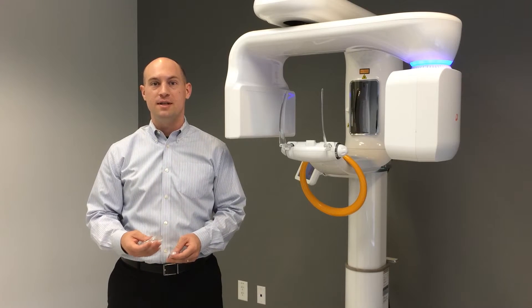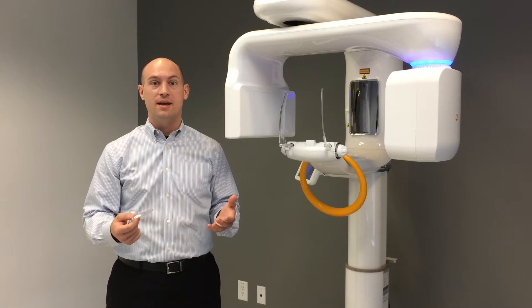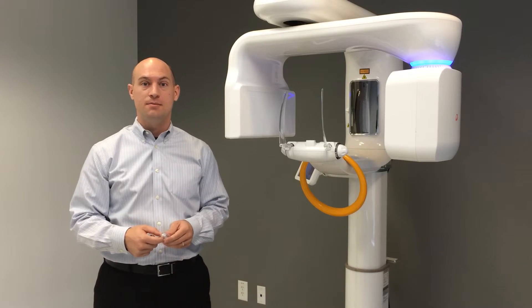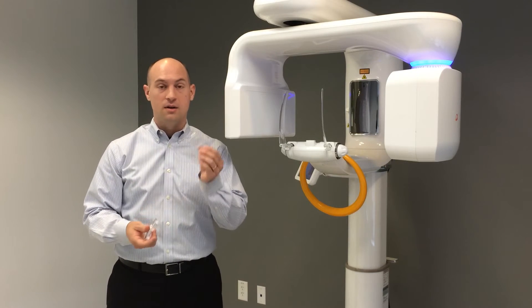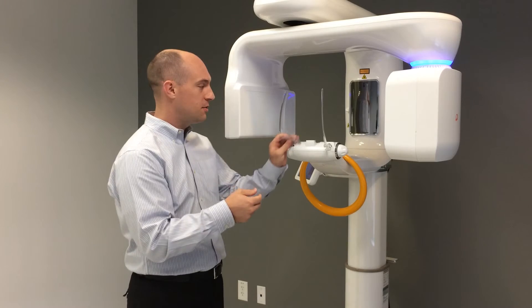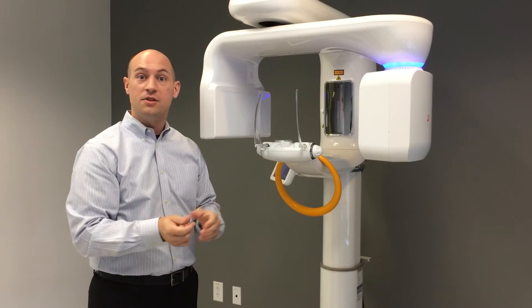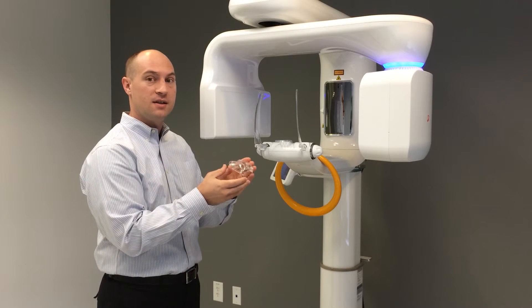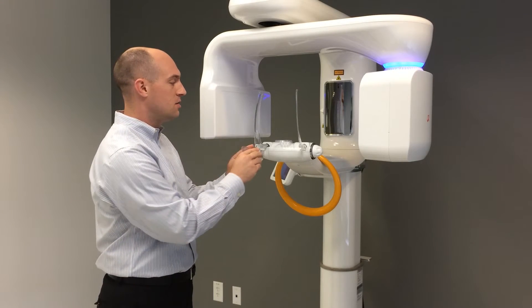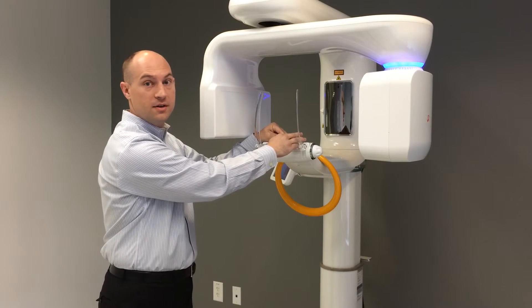Now before we position the patient for our three-dimensional TMJ acquisition, we want to prepare the unit. In this instance, we're going to take an image of the patient's left TM joint, so we're going to use our sinus chin rest as well as the edentulous cup chin rest. I'm going to place the sinus chin rest in first. And since we're going to take the patient's left TM joint, I'm going to offset the edentulous cup to the right side so that the patient's left joint will be centered in the machine.